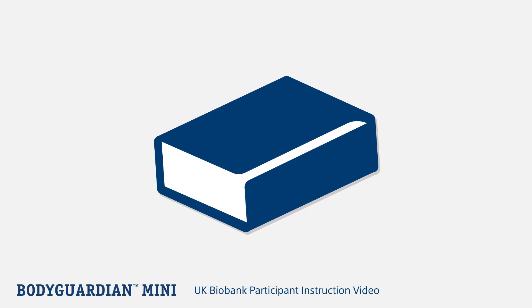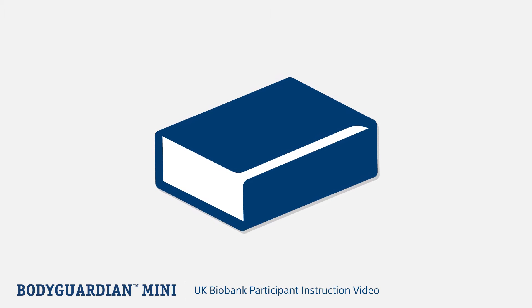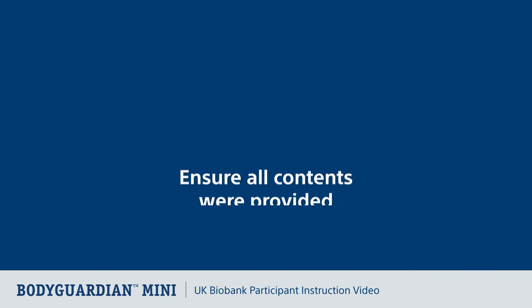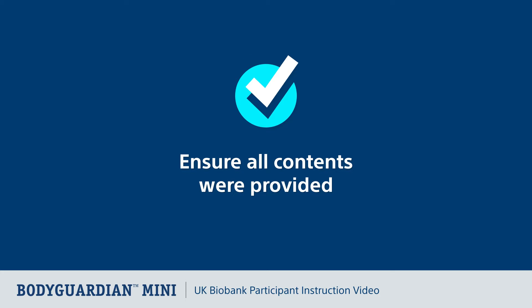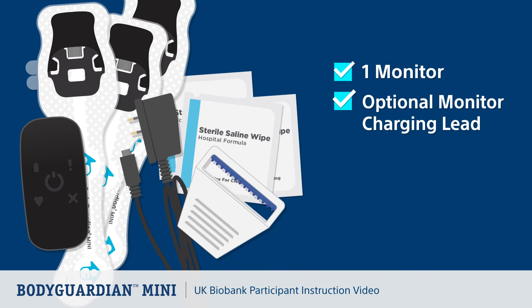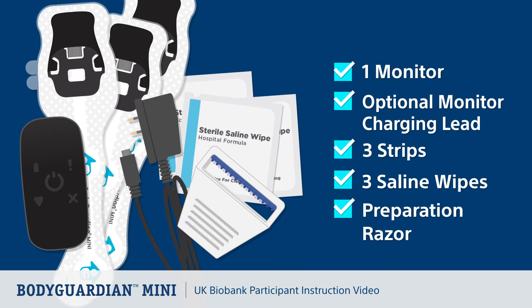As part of your study, you should have received the Bodyguardian Mini box with a participant instruction manual enclosed. Be sure to keep it handy. Please ensure all contents pictured on the participant instruction manual were provided, including one monitor, optional monitor, charging lead, three strips, three saline wipes, and a preparation razor.